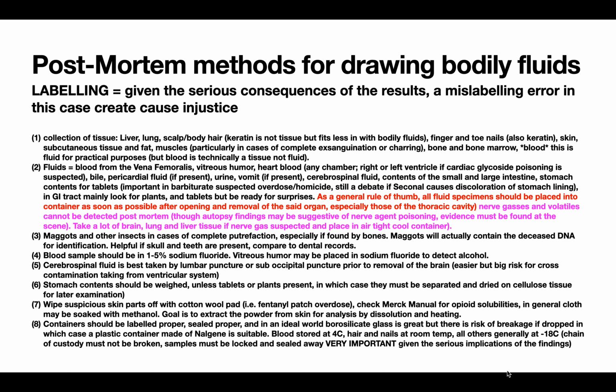Bile, you take all the bile, pericardial fluid if present, urine, vomit if present.